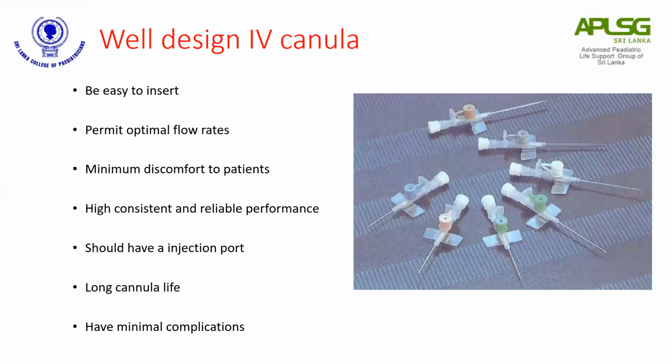So you can see in this picture, there are various sizes of cannula, with different colors. It is very important to select a good quality cannula, which means that it has to be inserted easily. It should permit optimal flow rate, and there should be minimal discomfort to the patient. It should have an injection port, a long cannula life, and only minimal complications.